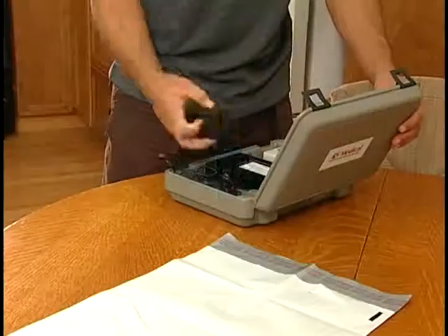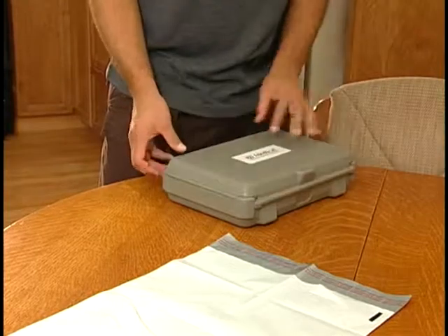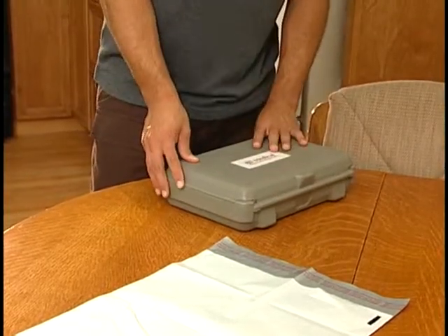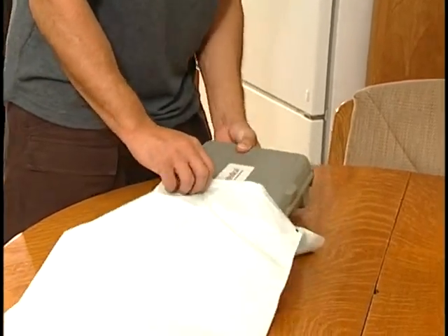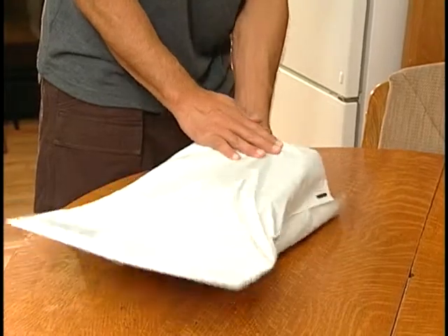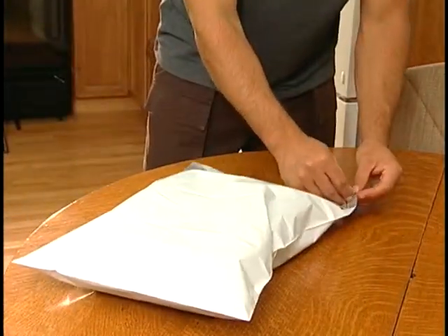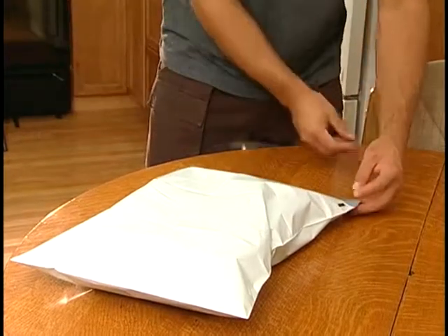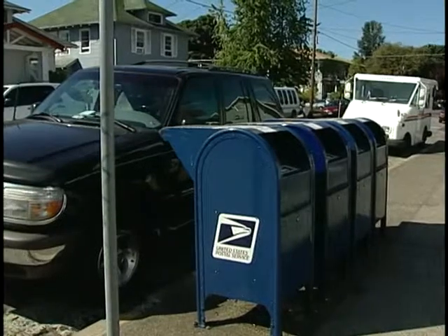At the end of your prescription, you will be asked to return the stimulator to RS Medical. To return the stimulator, use the white plastic return mailbag found in the carrying case. Pack the stimulator and all the accessories into the carrying case, then place the case into the mailbag and seal the bag. The postage for the mailbag has been prepaid — just drop off the package at any U.S. Post Office location.